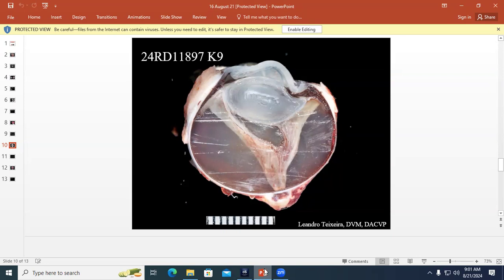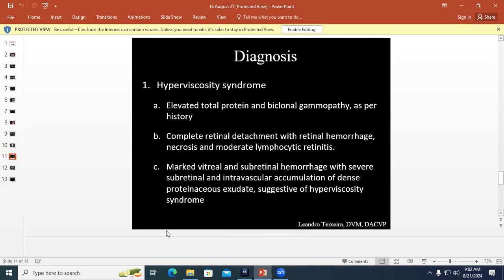We haven't got any follow-up. I asked for any additional information that they've received. The only thing they call is that there were some cutaneous lesions and the biopsy was not conclusive, but suggested a dermal lymphoma. So there's that. We haven't received confirmation of that. So here's a good example of hyperviscosity syndrome, which should lead the clinician to look for something systemic that's causing that.